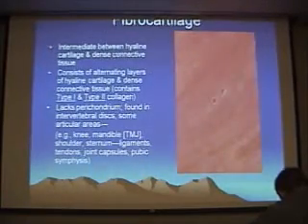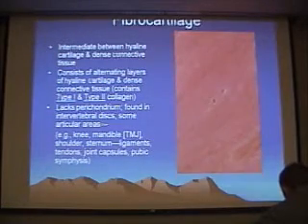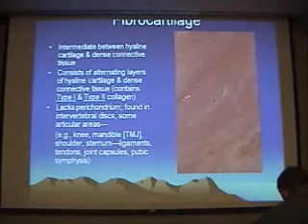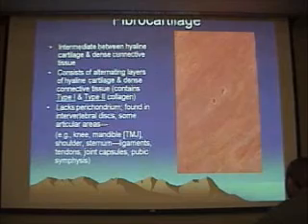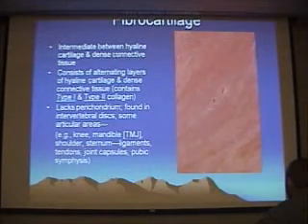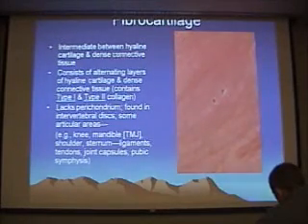Hyaline cartilage looks different from fibrocartilage, which, while it also has type 2 collagen, also has a lot of type 1 collagen. Basically, fibrocartilage is hyaline cartilage with lots of connective tissue added. So it has this very grainy, granular appearance to it, and it's also much less cellular. So you'll see many fewer chondrocytes within fibrocartilage.